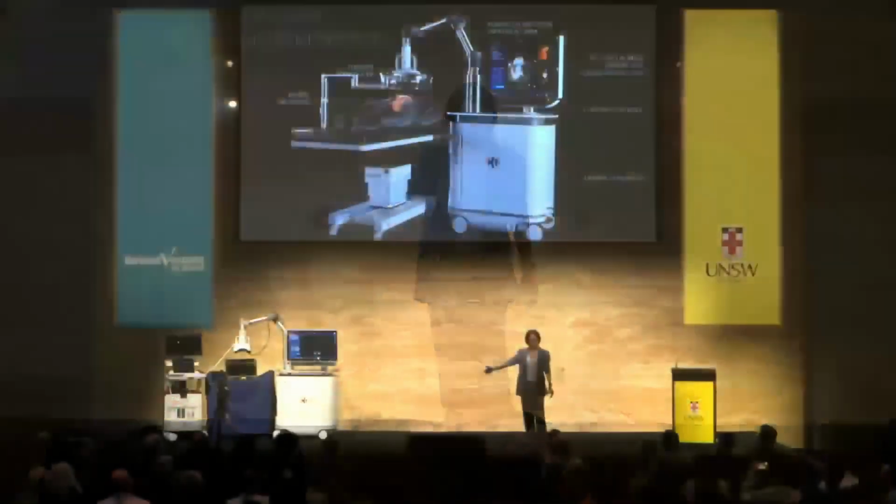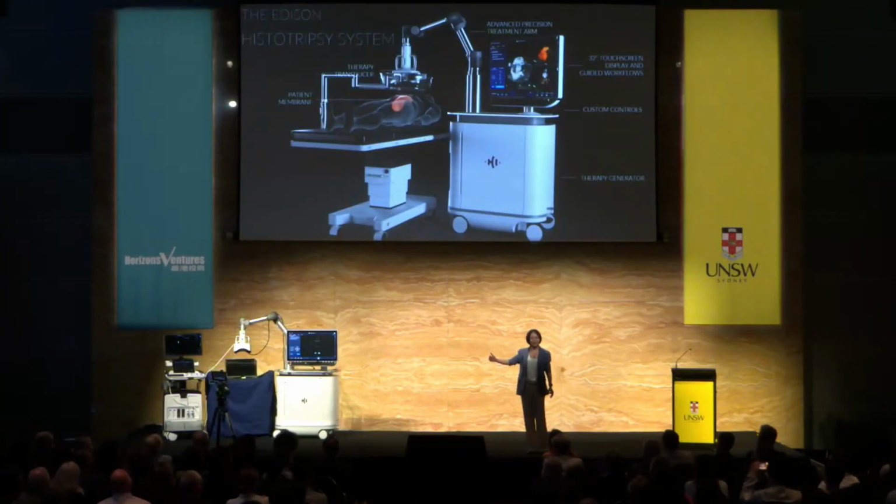Now we can actually treat through the skull, even into the brain, not just tumors but also neurological disease and stroke. So there are so many things histotripsy can do, but today you will see a clinical Edison system here to start with actual clinical patients with liver tumors and see how it's in action.